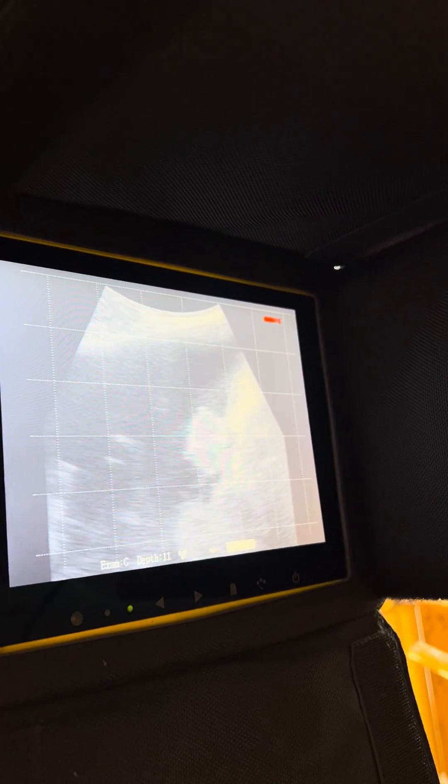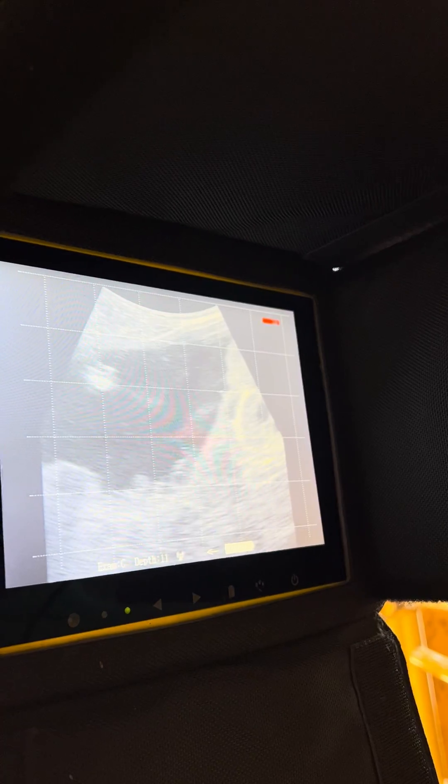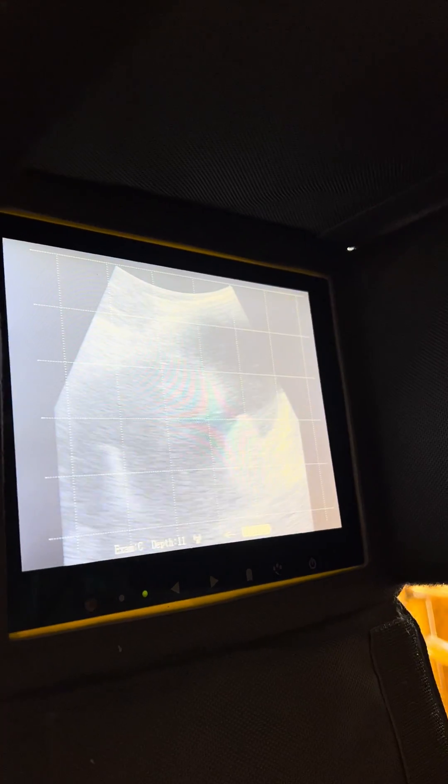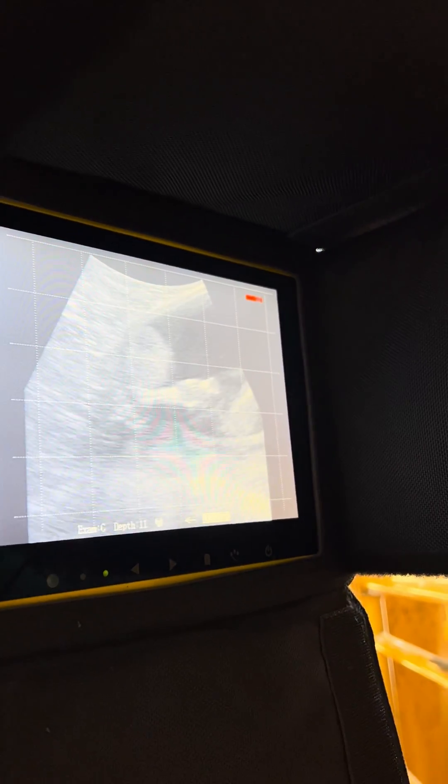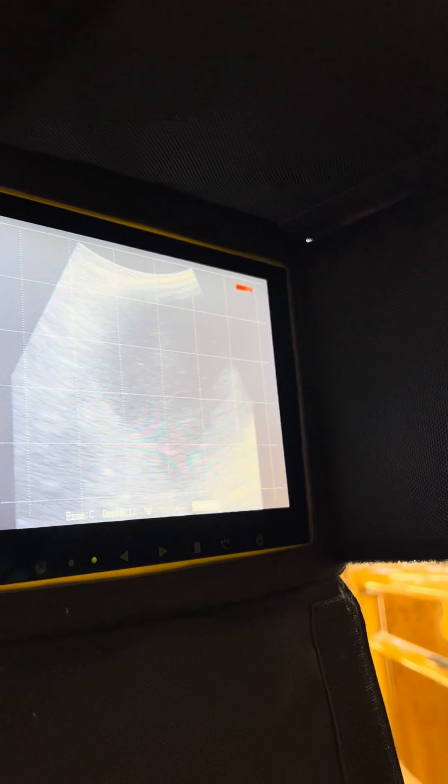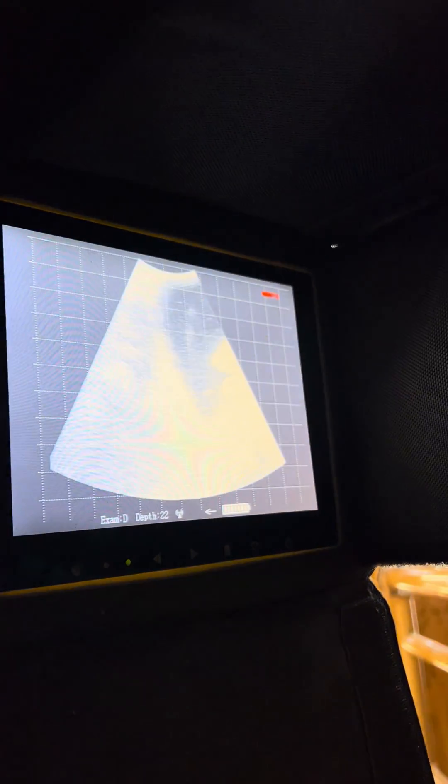Exam C is a little bit darker but quite a bit shallower. You can see this pregnancy is a little bit harder to see — there's part of the calf, but it's harder to age. It's a shallower, darker, and a little bit more detailed exam. This exam is really helpful for shortbreds or open heifers — a great place to start if you need a little bit more detail.